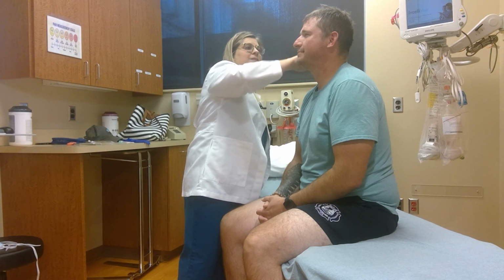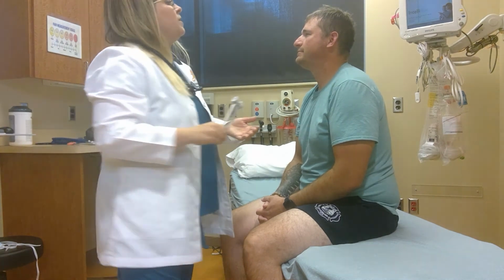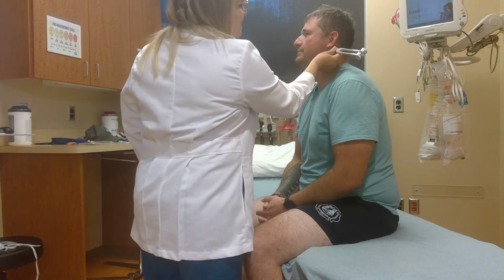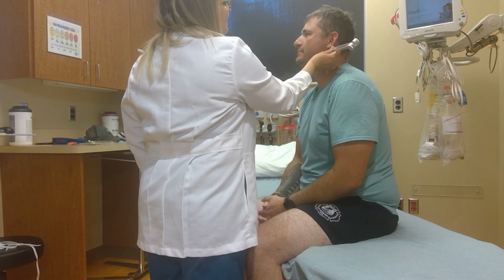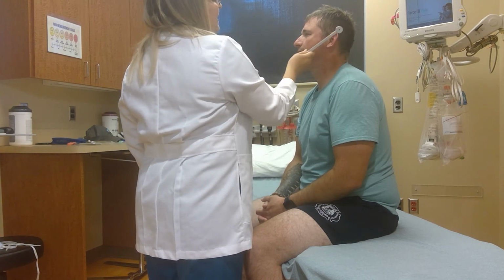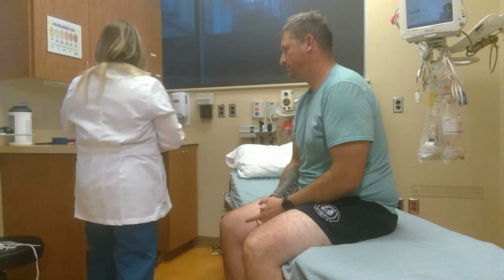Stop. Okay, and do you hear that now? Yep. Okay, good. And now we're going to go on to this side. Place that there on the mastoid bone. Tell me when you stop hearing it. Stop. Okay. Yep. Okay, very good.